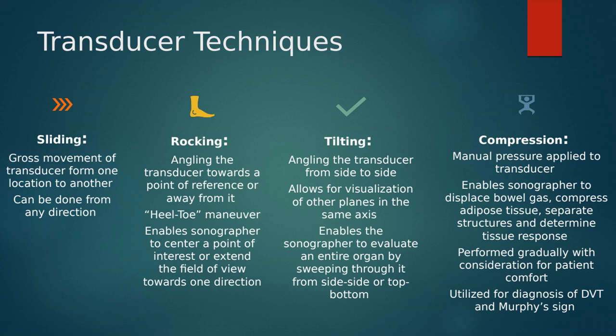So we're going to learn that pressure is important, and your pressure will start to increase over time as you become more comfortable scanning each other. But I'm sure you guys have noticed the difference of when I scan you versus when your partner scans you. And that's going to be a big difference in the quality of your pictures.